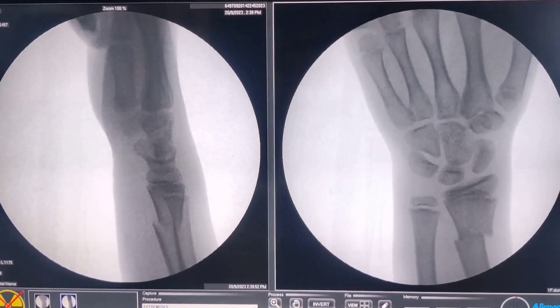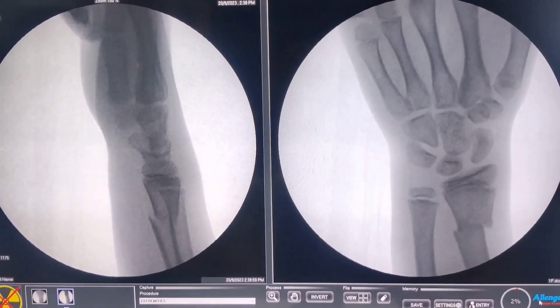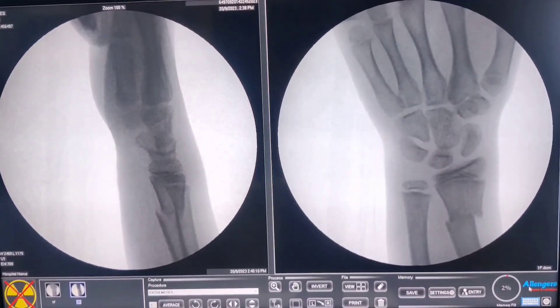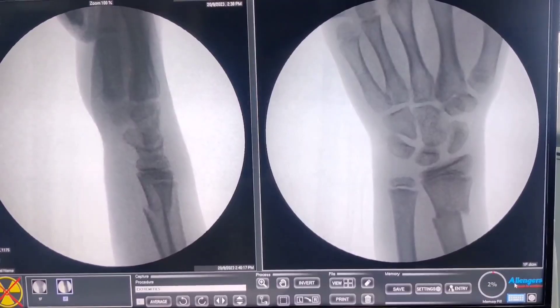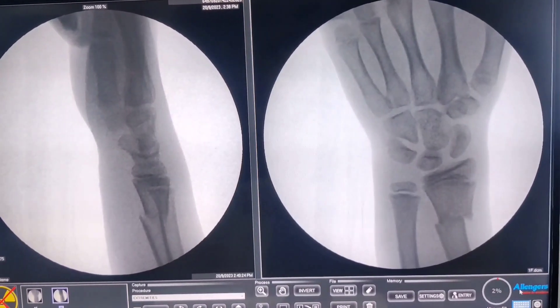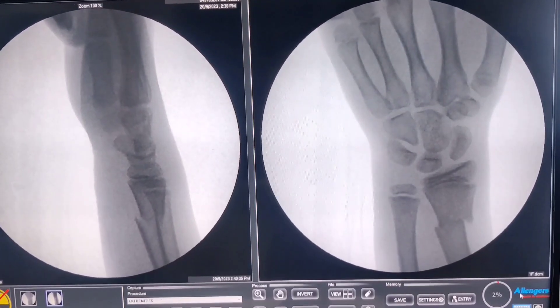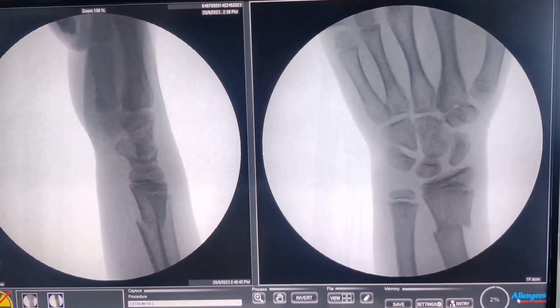First, take initial C-arm images. Looking at the AP and lateral, there is almost more than 80 percent cortical opposition — it is not too bad and would remodel beautifully in plaster even in this position. However, this child is nearing 14 and approaching skeletal maturity, and in India parents want the bone to be absolutely straight and it can be a struggle to explain that the X-ray does not have to be perfect all the time. Our next goal will be to reduce it, take further images, assess stability, and secure with wire if necessary.